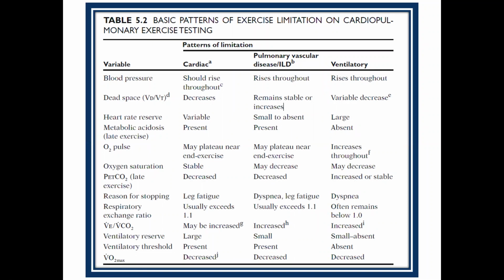Like I said, it's an independent predictor of heart failure. Sometimes it is a cardiac limitation, but your peak VO2 is above the cutoffs that we use for, say, transplant listing. It's still a cardiac limitation to exercise. No, that is not the way you'll distinguish. We'll go over how to distinguish. But yes, the VE VCO2 is not at all specific for cardiac limitation.